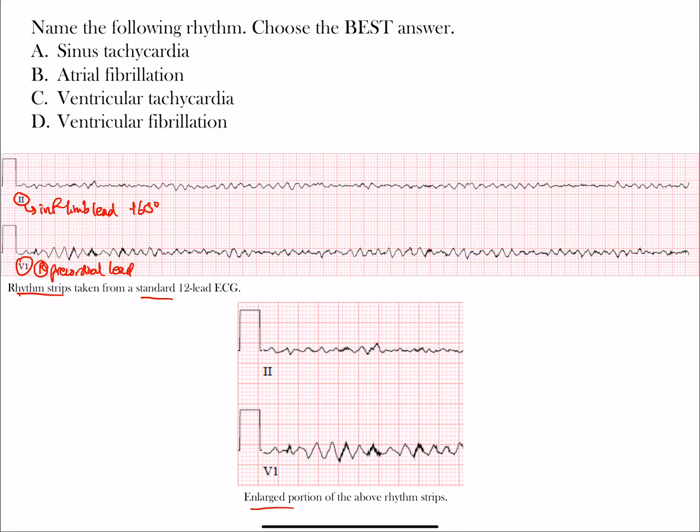Let's go through each answer choice to make sure we understand not only why the correct answer is right, but also why the other ones are not correct.